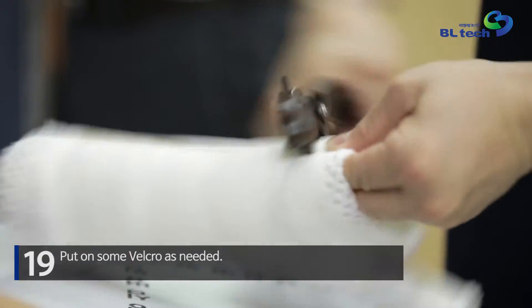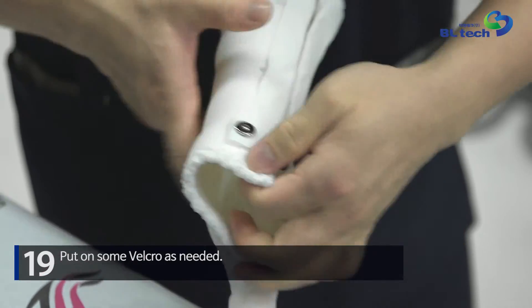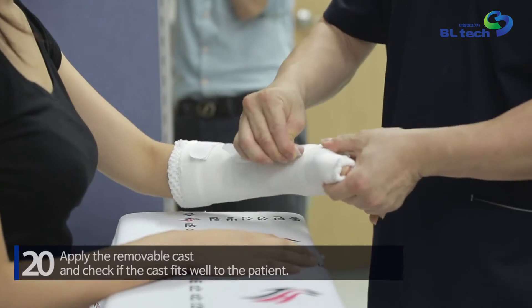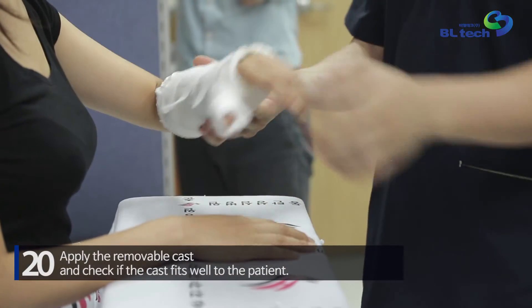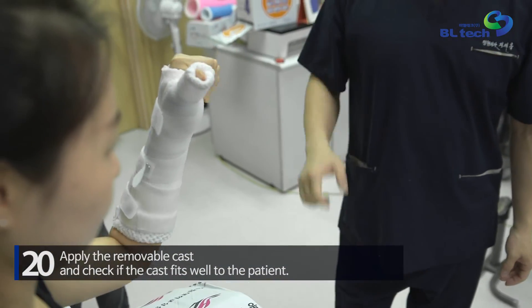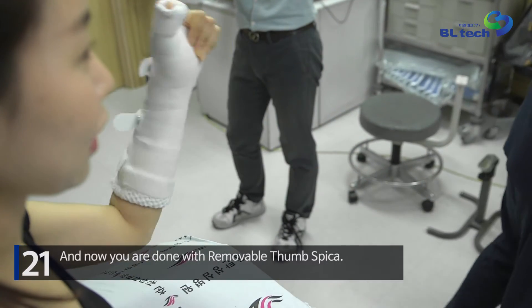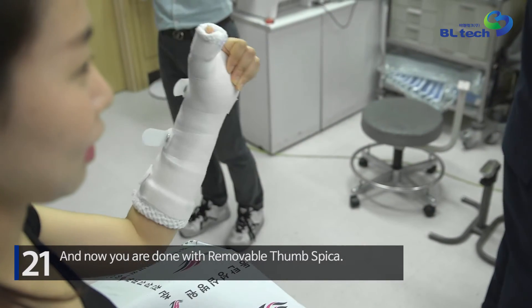Put on some velcro as needed. Apply the removable cast and check if the cast fits well to the patient. And now you are done with the removable thumb spica.